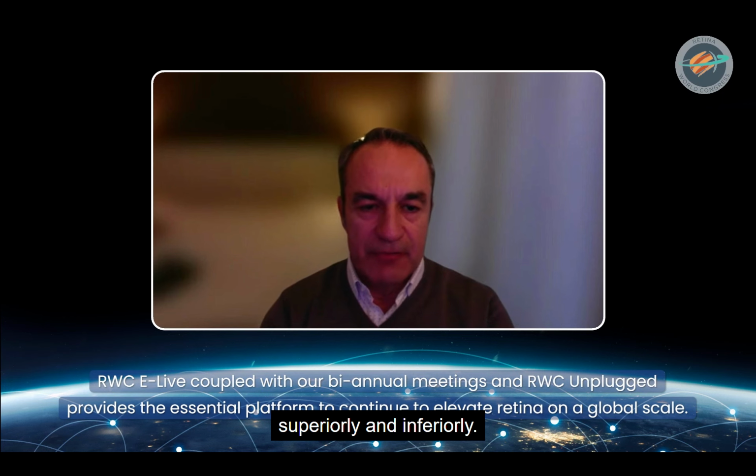Did you apply laser all around the retinal tear? No, just at the edges. Just at the two edges. Very, very minimal laser at the two edges, superiorly and inferiorly.